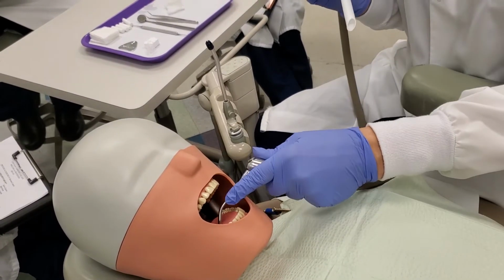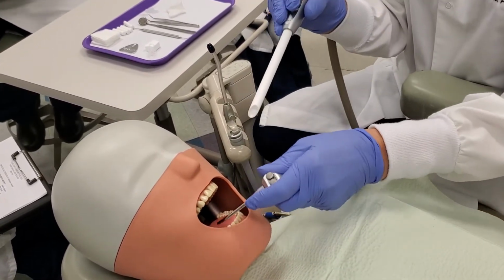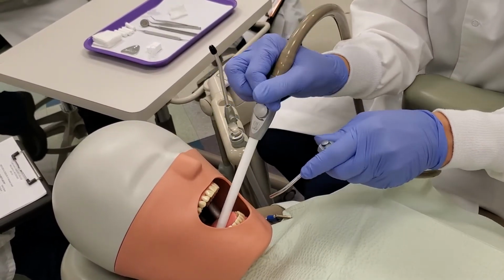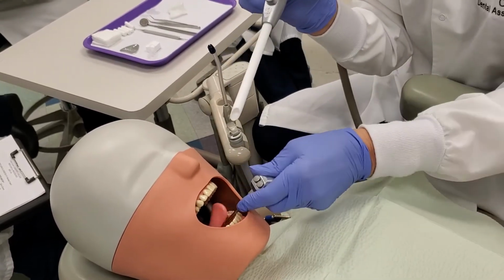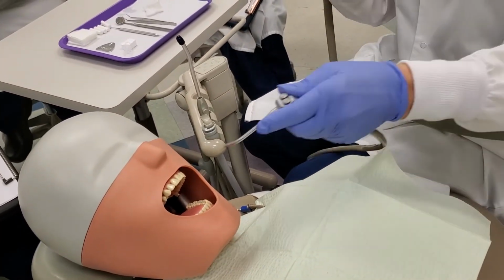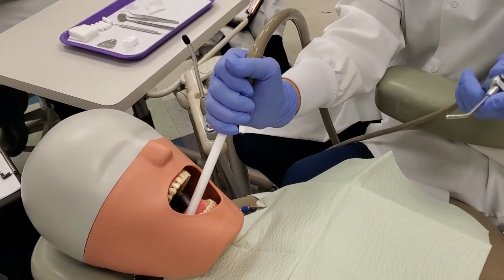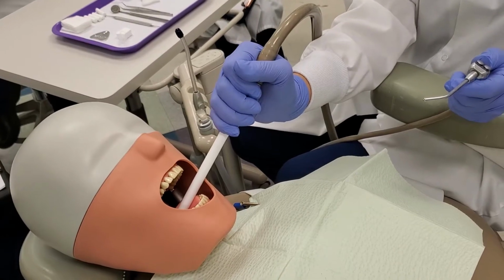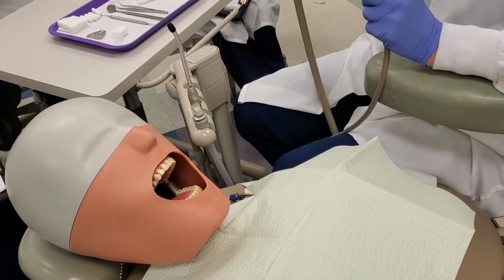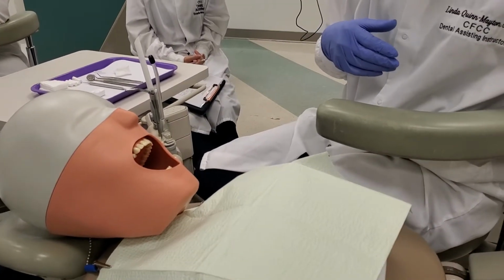So you're going to retract with the air water syringe tip, and then you're going to come in. Again, you're retracting, so you're going to come in, turn it on. We're going to have to find us a good air water that's not twisting around. Okay. And then once you get the tongue retracted, you come in with the HVE and place it in. And then remove the HVE and turn it off. Okay, so that's the first part. That's the demonstration for using with retraction.